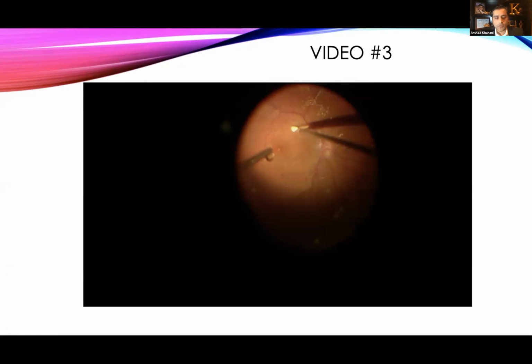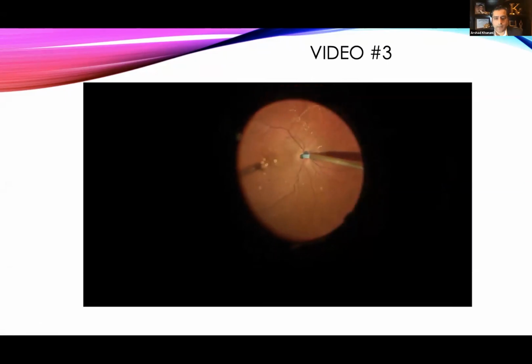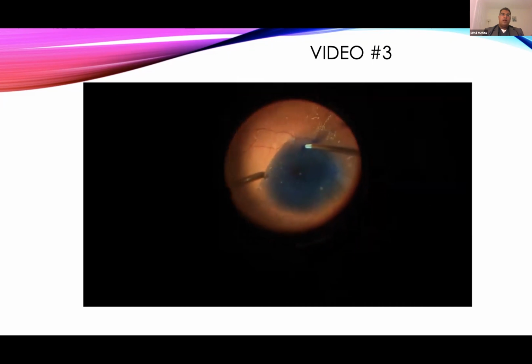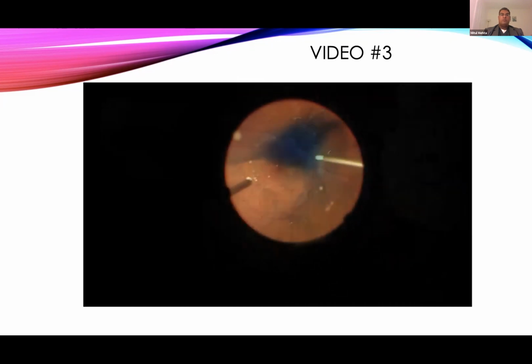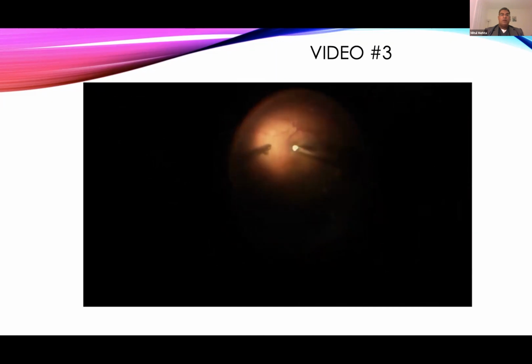So Mittul, this is your video, right? Your fellow? Yes. Okay, so go ahead and tell us what's happening here. This is a case that had an ERM as well as ILM to be stained. They start with triamcinolone to stain the vitreous and make sure the PVD is up. And you saw the scraping a little bit there of the edge of the ERM and ILM at the same time with the membrane scraper.